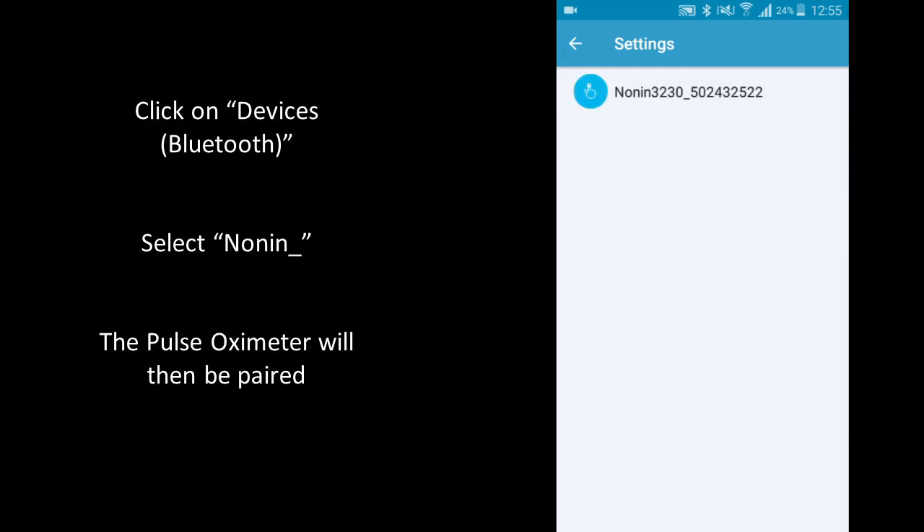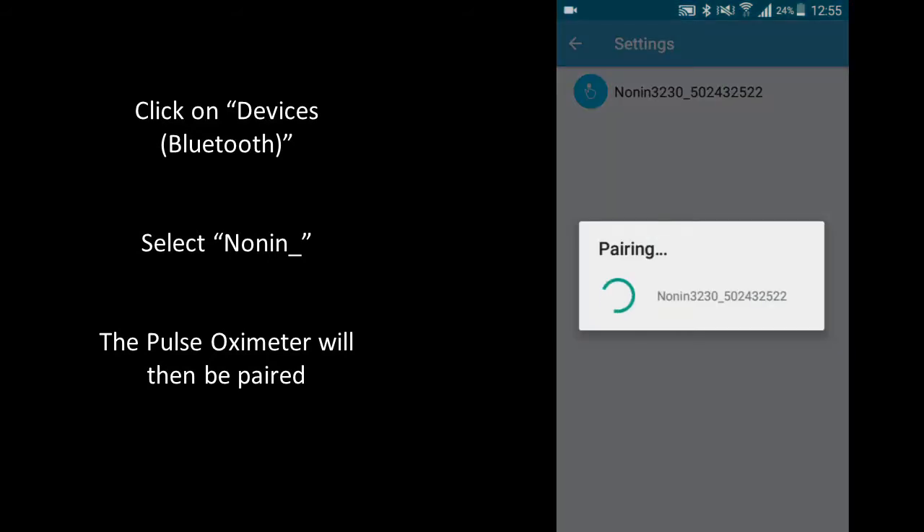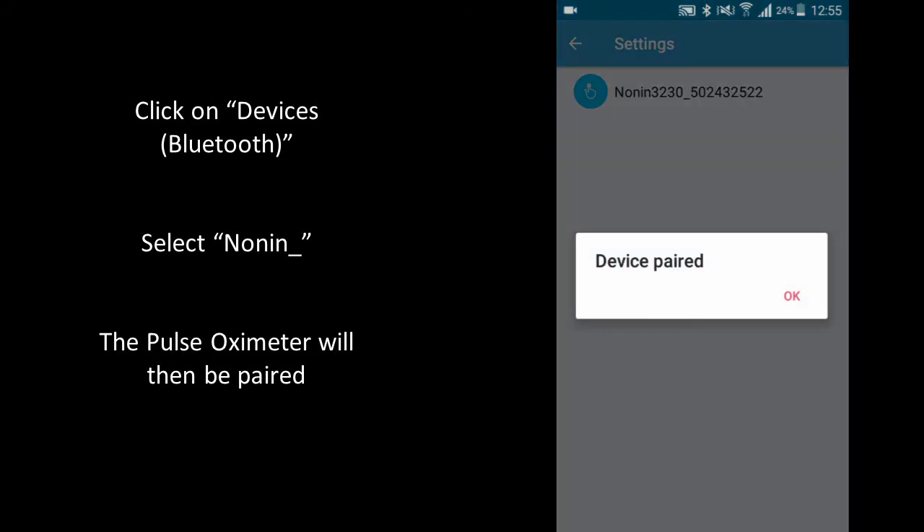You should see Nonin 3230 followed by a sequence of numbers appear, and select this. When the device is paired you'll see a device paired message.